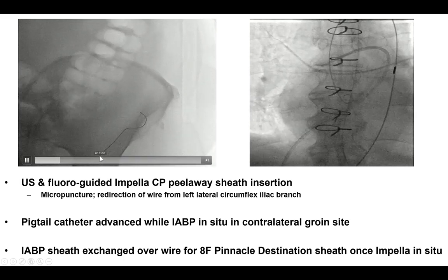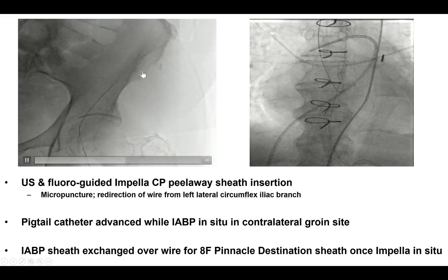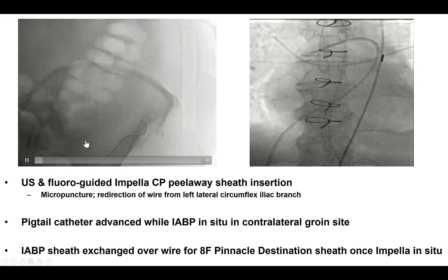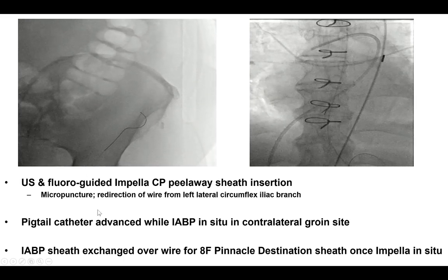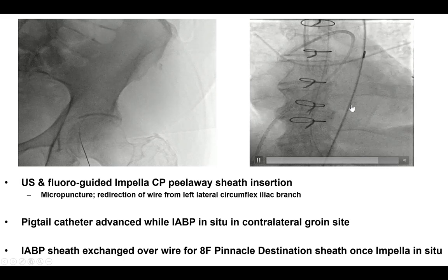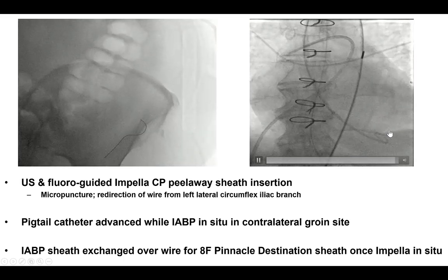The wire here — the micropuncture wire — is going into the lateral circumflex iliac, something critical to find soon; otherwise, if equipment is advanced, this will likely lead to a significant perforation. A pigtail was inserted into the left ventricle, through which we were able to insert the Impella device.